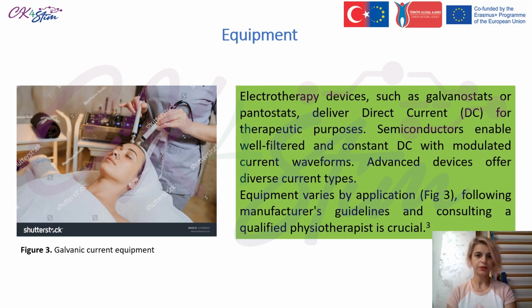Electrotherapy devices, including galvanostats and pantostats, are designed to administer direct current for therapeutic utility. Leveraging semiconductors, these devices provide well-filtered and consistent direct current with modulated current waveforms.